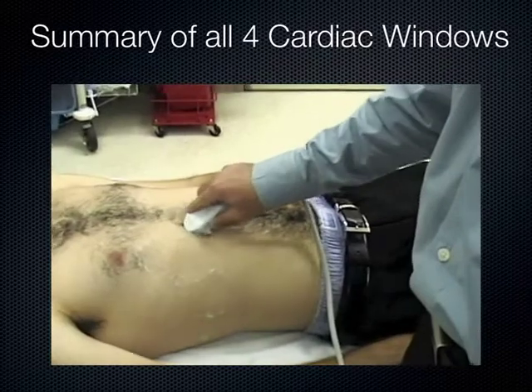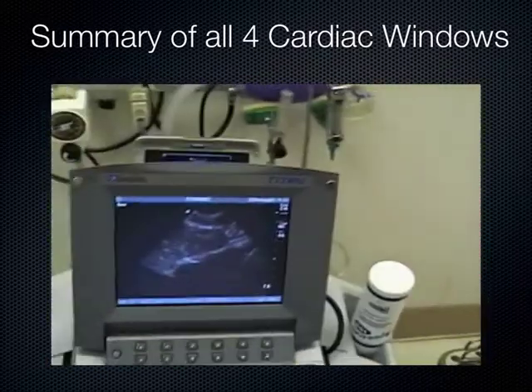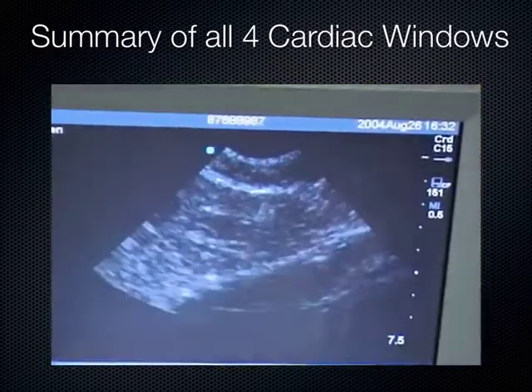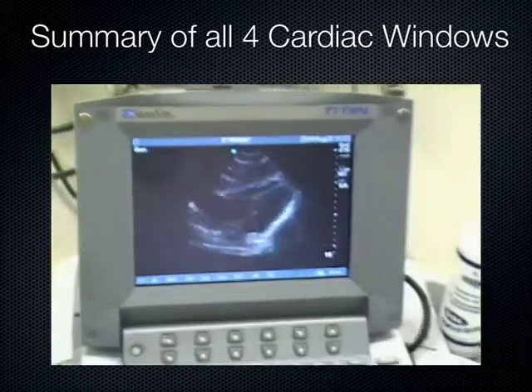And the first view I usually do is a subcostal view. Now if you look at the screen, what's the problem here? My depth is too low. It's at 7.5 and I'm just seeing barely part of the right ventricle. So I want to go down on the depth. In fact, when you do a subcostal view, you want to go down quite far on the depth.